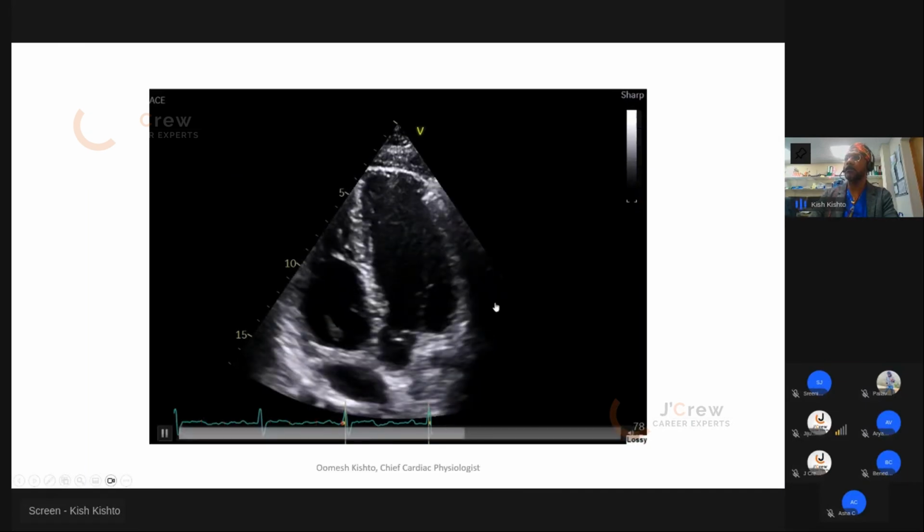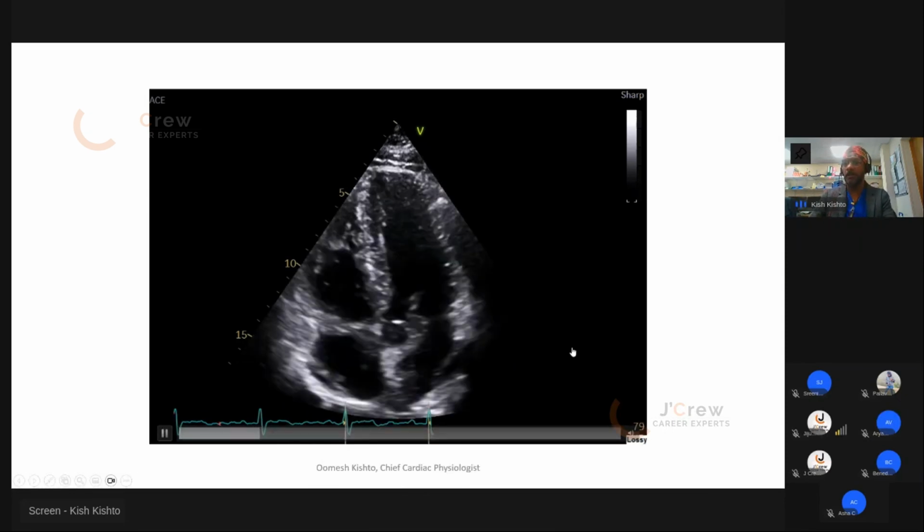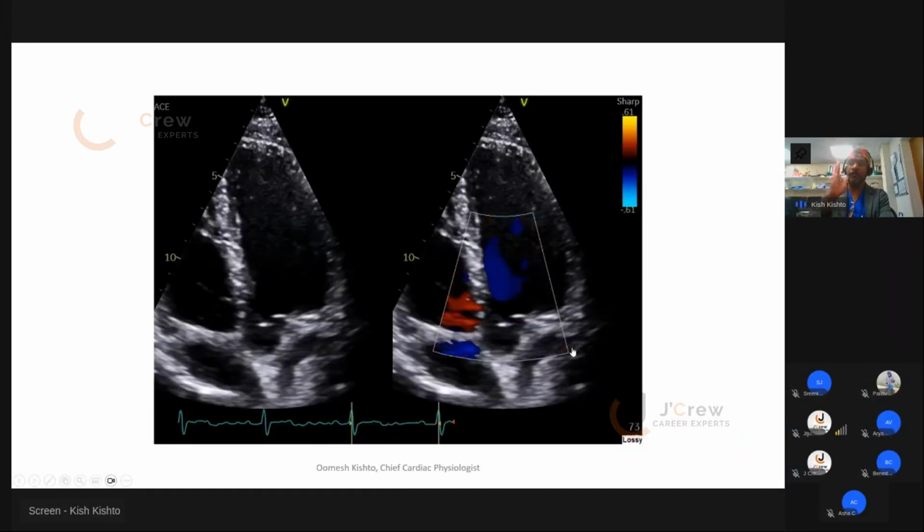Okay, so then we look at the five chamber view and focus on the aortic level there. Again, try to move just the end bit of your probe, not the whole probe, so that you align your heart properly with the AV perpendicular to the probe. That's when you put your cursor on it, and you're nice and perpendicular, which will catch the opening of the valve nicely.